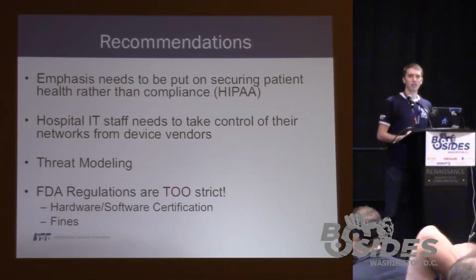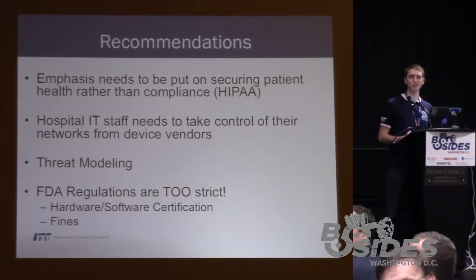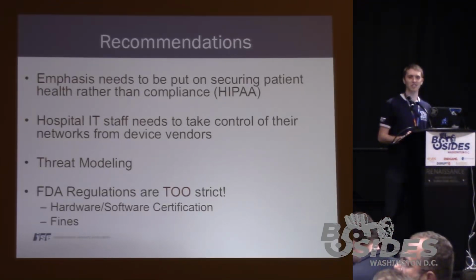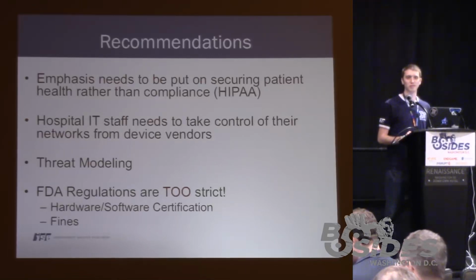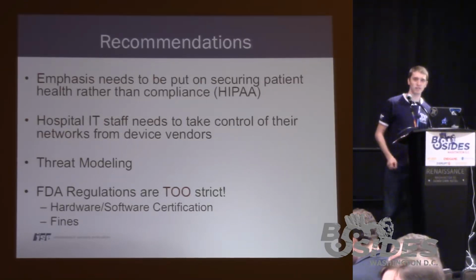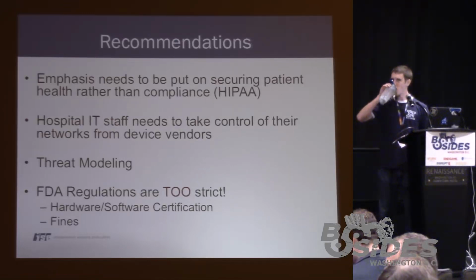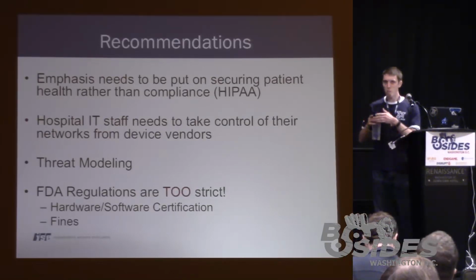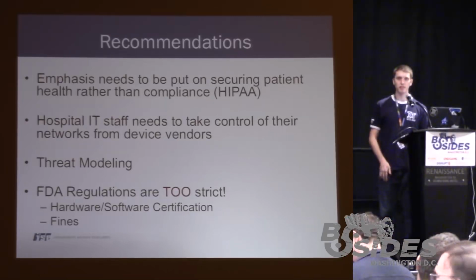I was just going to say, I used to do FDA evaluation work a long time ago. So it'll typically be a 4-month to 12-month process. It's all documentation. About one of the 14 or 15 areas has to do with security, the rest of it doesn't. So it's all about creating repeatable behavior, so that if there's a recall, you can say what happened and why did we miss it? So it's all about looking backwards. It's not at all about security. But it's such a long and expensive process that they are very hesitant to jump.